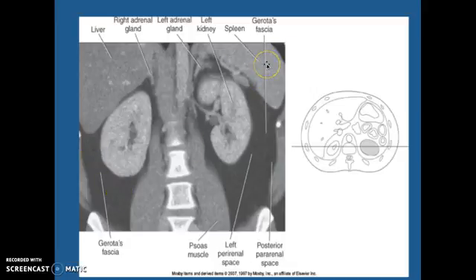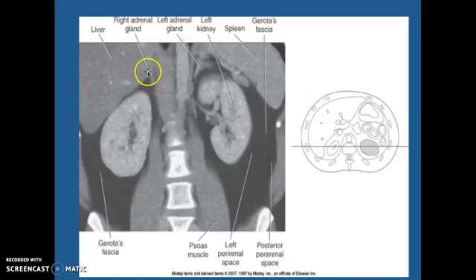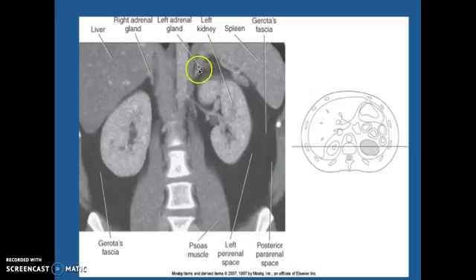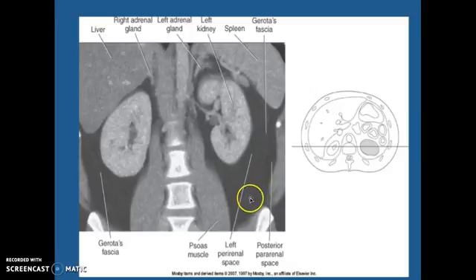This is a CT reformatted into the coronal plane. If we're looking here, here's your liver, your right adrenal gland, right there, little thing. Here's your left adrenal gland. Here's your left kidney, your spleen, Gerota's fascia, and I want you to know your psoas muscle.